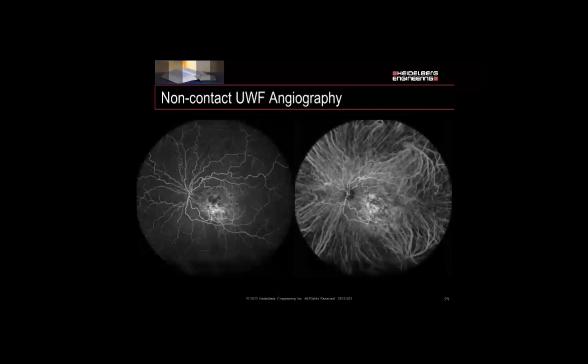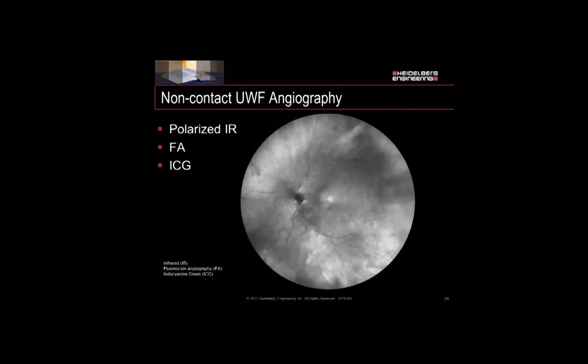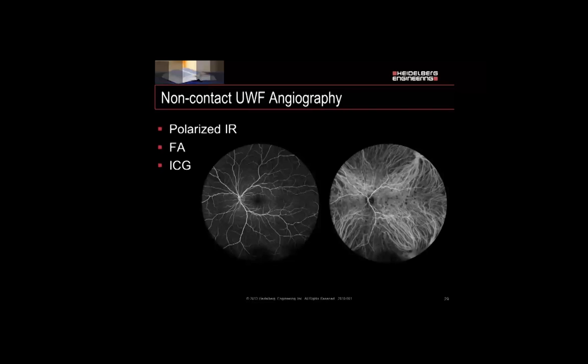Here's our image for the non-contact Ultra Wide Field lens. You can do fluorescein and ICG, individually or simultaneously, with this lens. What we notice is it's sharp all the way around and evenly illuminated. Comparing it to the 30 and 55, we can see the 30-degree in a yellow box and the 55 in orange — we're just covering a whole lot more ground with one image, so a lot less work doing fields. With our lens, we're able to do polarized infrared photo, fluorescein, and ICG.